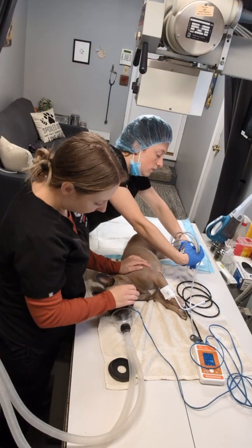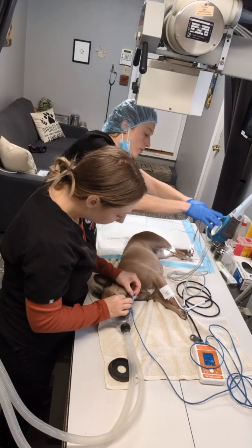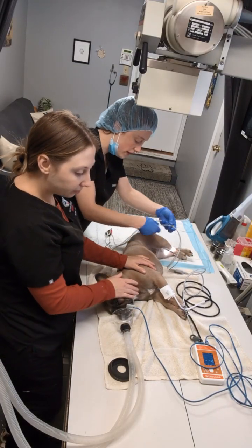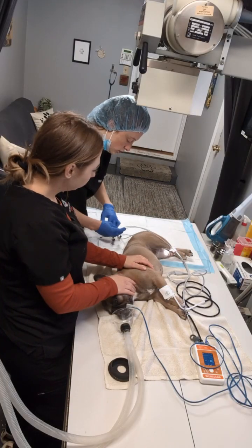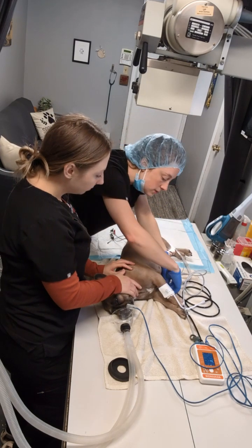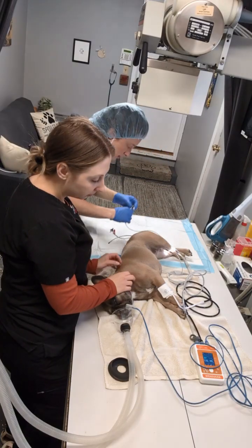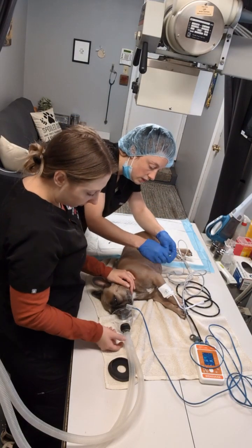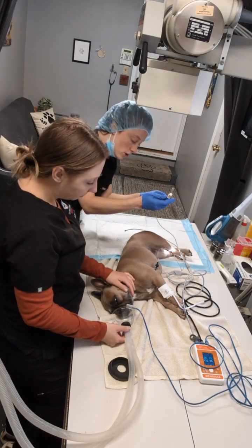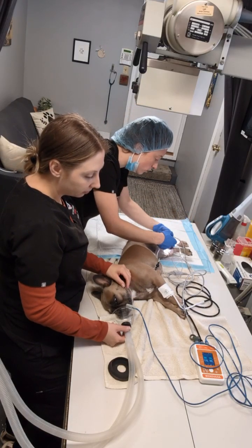And then we have our ECG that will help monitor and display the heart rhythm. It'll also help with the heart rate. So it has 3 electrodes. The white electrode is going to go on the right arm proximal to the elbow. It just attaches to the skin. The black electrode goes on the left arm proximal to the elbow. And the red goes on the hind limb. I'm going to do the left limb proximal to the stifle.